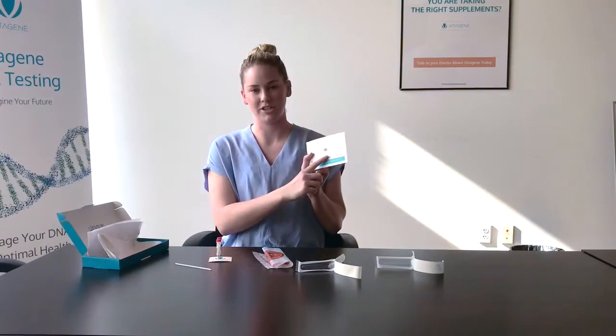Before placing in your biohazard bag, make sure that each of the codes on your vial matches the code on the back of your box and on the back of your instruction card.